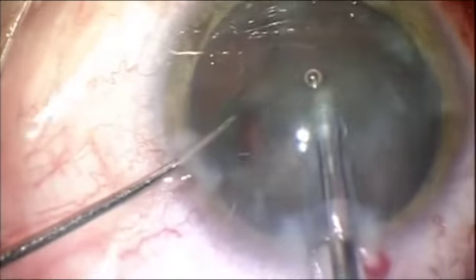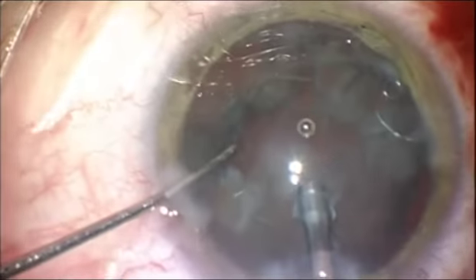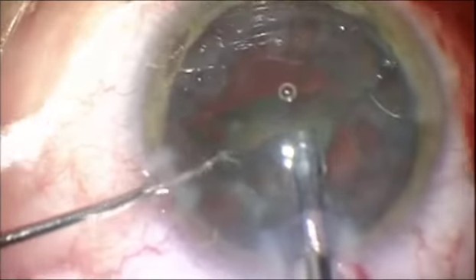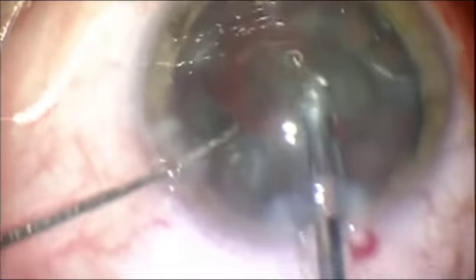Minimal rotation in that step is required to avoid any significant stress on the zonular apparatus.